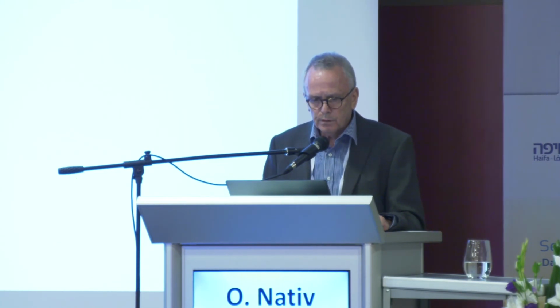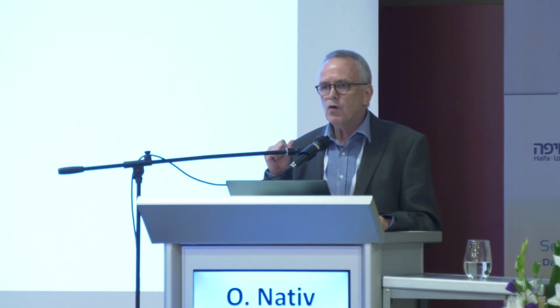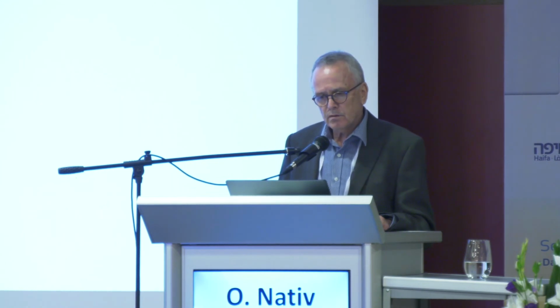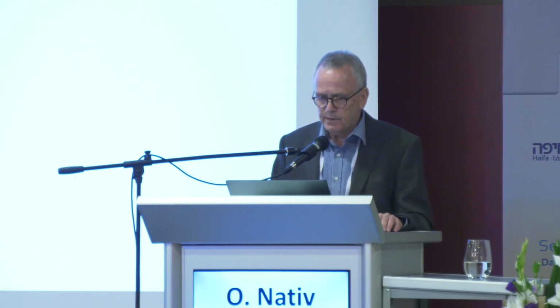So, in summary, cryoablation for renal tumor is feasible, it is safe, effective, low complication rate, it is cost effective, and it can be repeated easily. Let me add something else which I saw in the first movie, the 16 millimeter black and white. It is quick. It is quick. And let me tell you from my experience, we do a lot of surgery, but when we do the cryoablation in the morning as the first procedure, at noontime the patients are running to eat. And if they are doing surgery, they still don't understand that they are after the surgery.